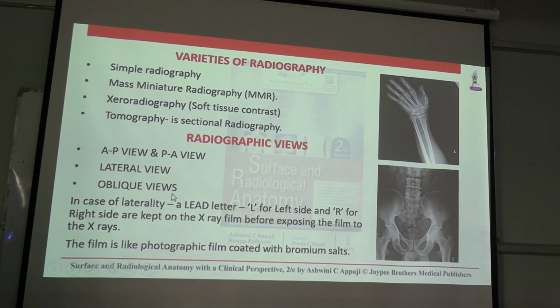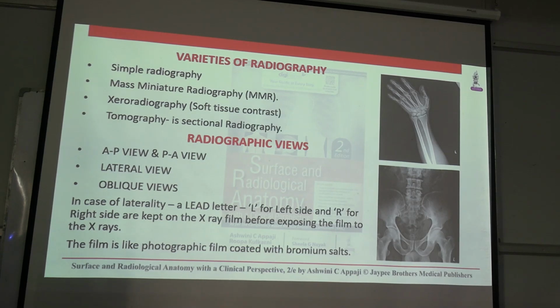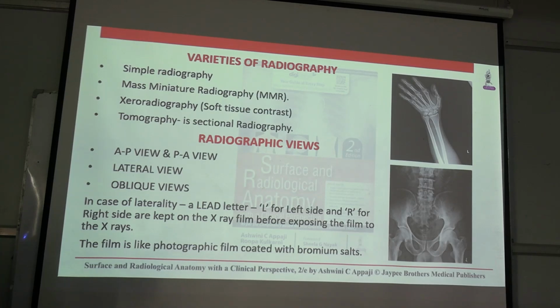We understand the meaning of it, how these lights are coming to us and penetrating, assuming we are standing in the normal anatomical position, facing this particular thing. If it is shifted to the back, on my back, and projected from the back side, I have to keep the film in front. So it is penetrating from the back side, and then that view will be the PA view.